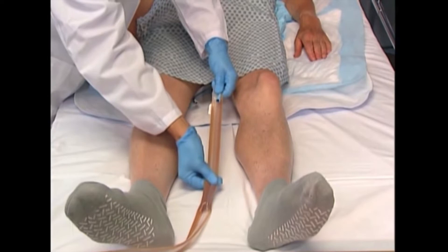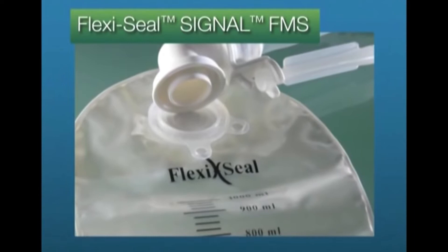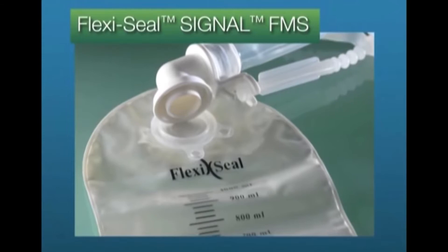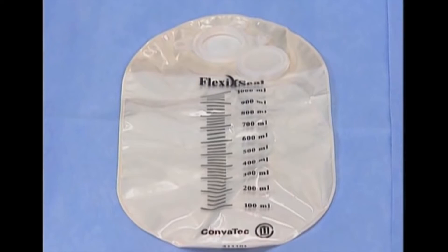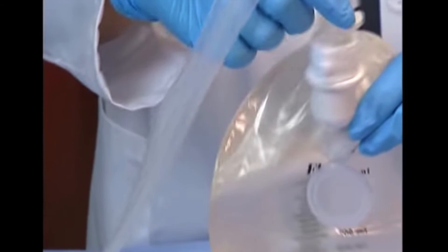FlexiSeal Signal FMS is a simple and closed system. All parts are disposable and designed for single patient use. The closed-end collection bag helps prevent the spread of infection such as C. difficile. The collection bags have a charcoal filter and are designed to contain and lock in odor, similar to the material construction of the Convatec Ostomy care pouches. FlexiSeal Signal FMS also has an elbow bag connector for easy operation. The connector includes a hook that interfaces with the collection bag, adding an additional layer of security.